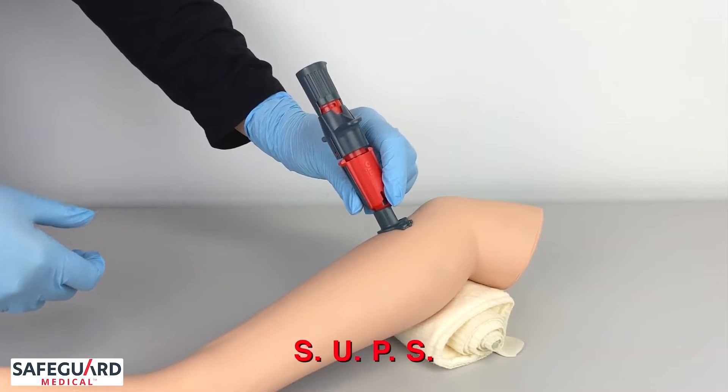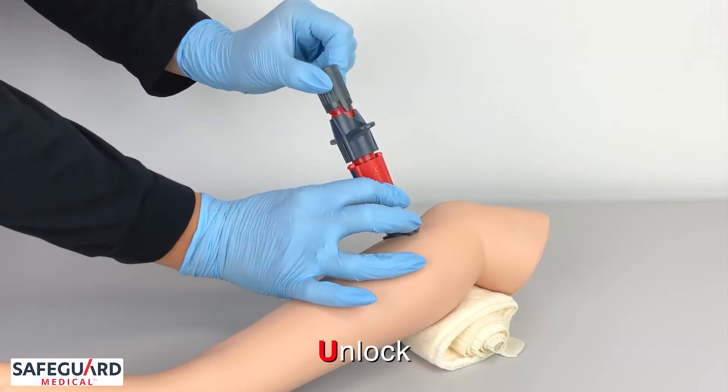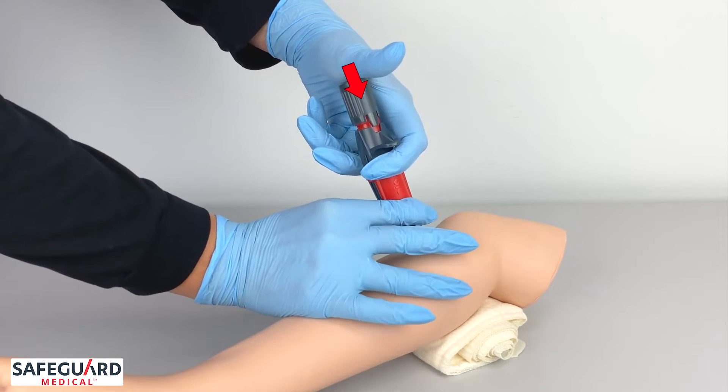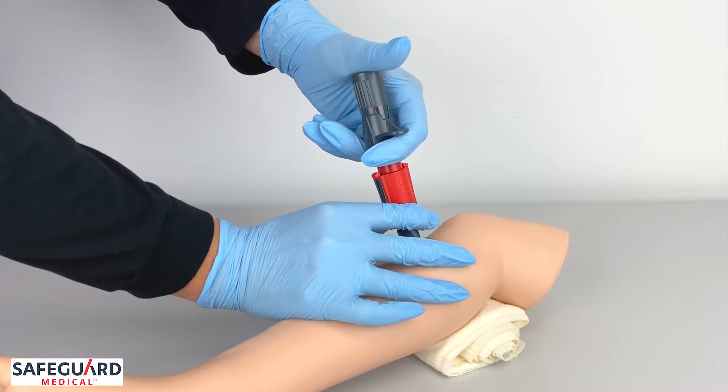I'm going to follow the SUPS method: stabilize, unlock, press. As I press, I'm gently going to squeeze the trigger wings to deploy the device.